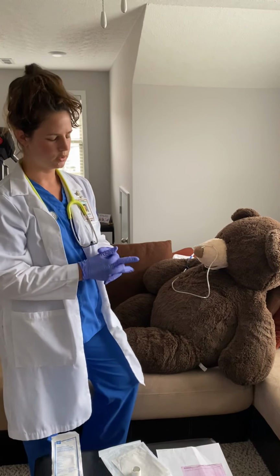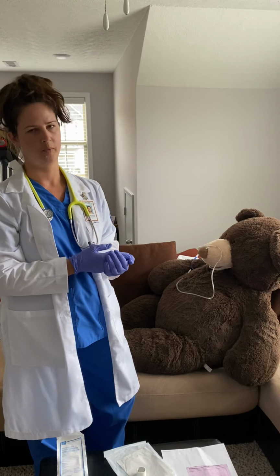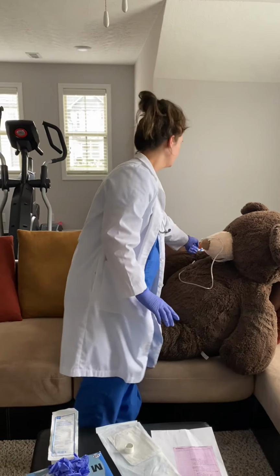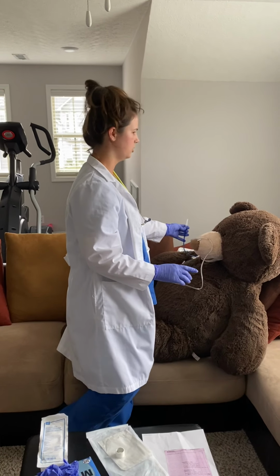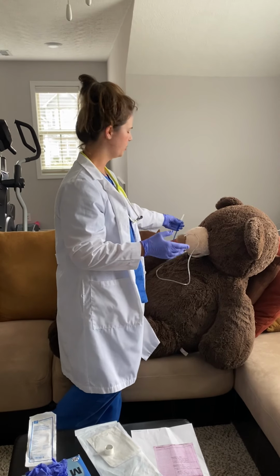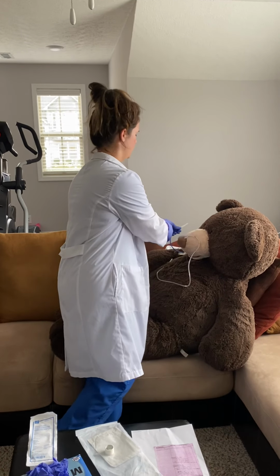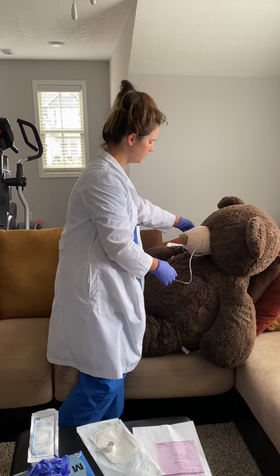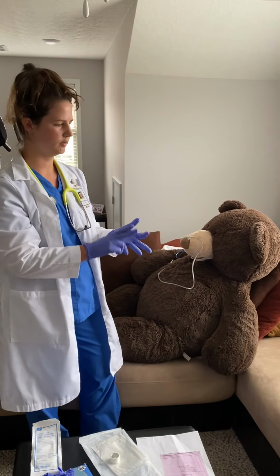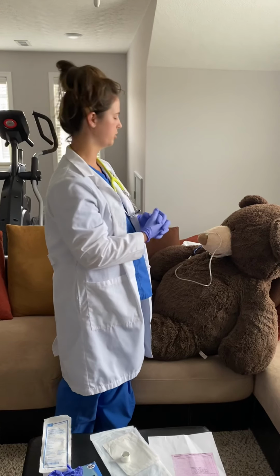So this patient, since they're getting the nasal gastric tube for no bowel movements for the past 8 days, we're going to be hooking up the NG tube to the facility's suctioning, whether it be on the wall or a machine. And we're going to be putting it on low intermittent suction. So you would go ahead and screw that on and make sure the patient again is in the proper position. Before you do any suctioning, lavage, or gavage, you always want to make sure you have confirmed placement of the tube before doing any of those procedures.